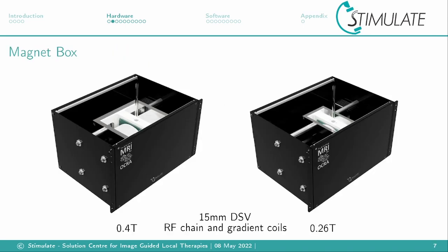For the magnet we developed two versions in the meantime. We started with the big magnet with 0.4 Tesla field strength in a 50 mm measurement volume. On assembly this was very hard due to the enormous forces of the magnets. We figured out that the alignment and field homogeneity is much more important than field strength. So we went a step back to smaller magnets, which we can align much better. With this we achieved a field strength of 0.26 Tesla.